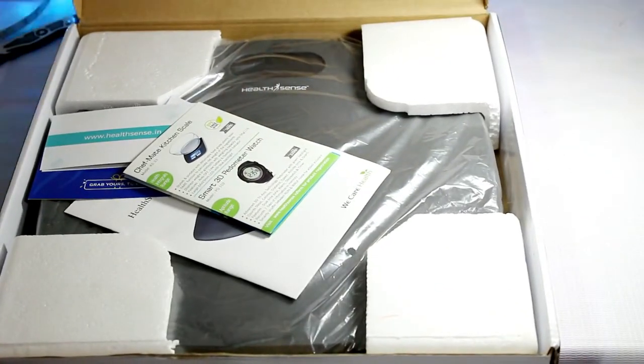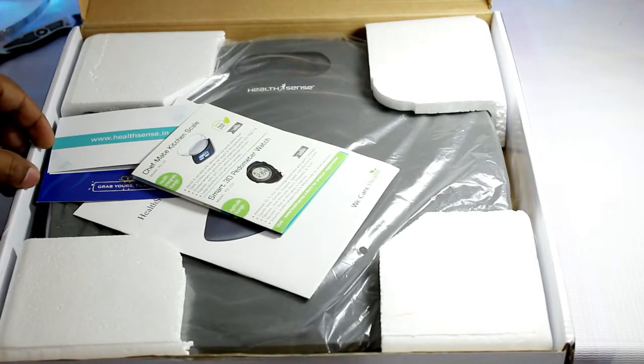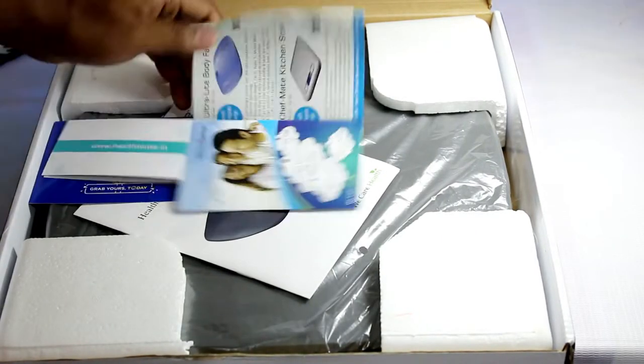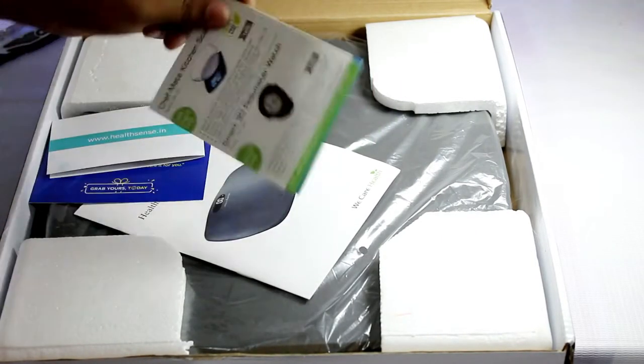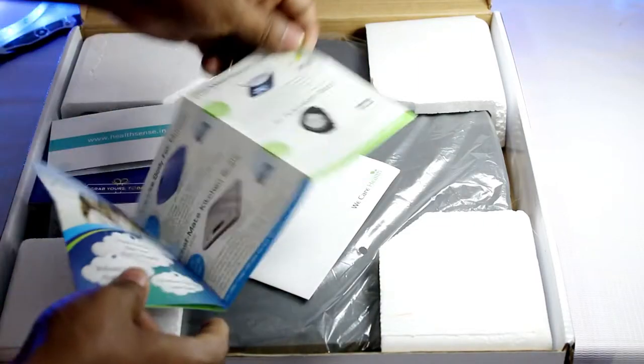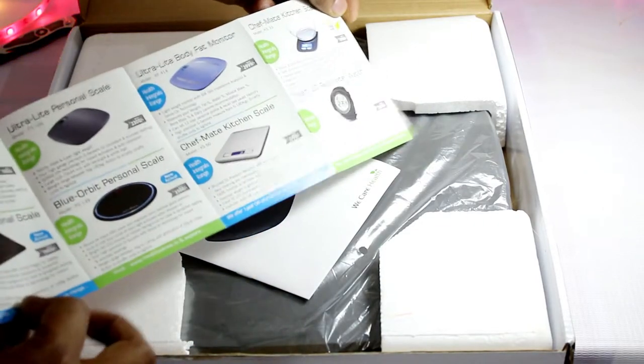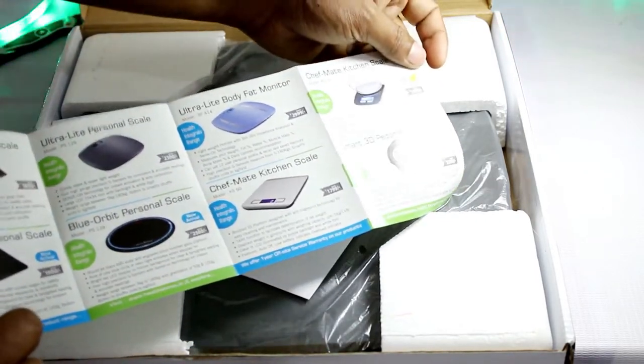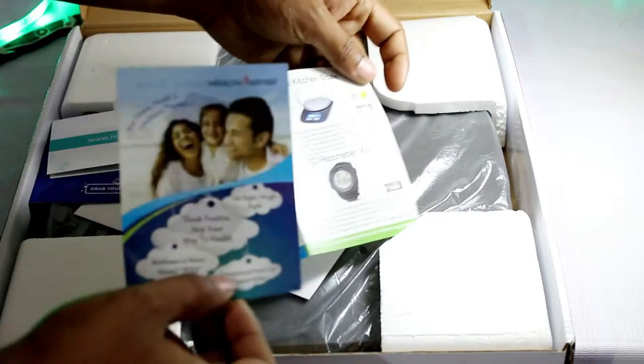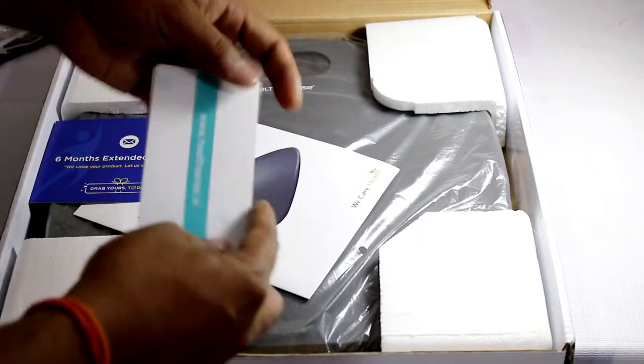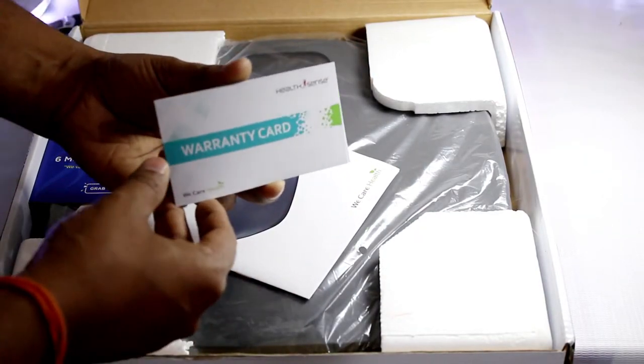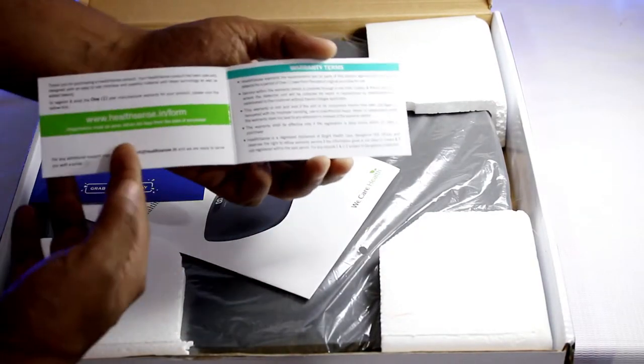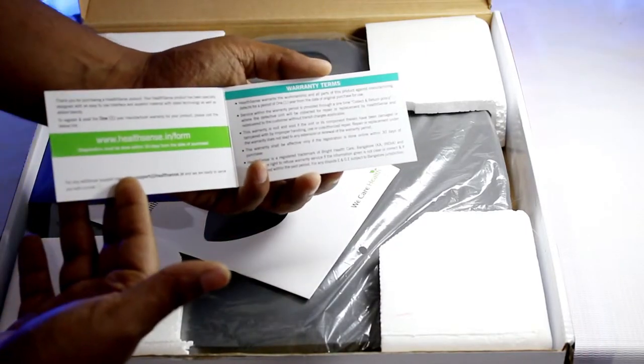Alright, well packaged safe and securely kept in thermocol. So first thing here is actually a pamphlet from HealthSense telling about some of the other products manufactured by them which you can choose to buy.